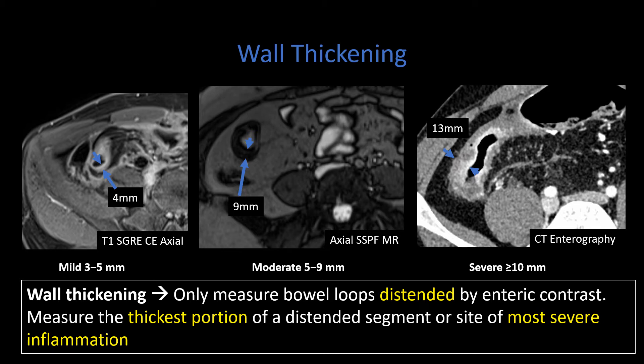When you think about wall thickening, there are different grades — mild, moderate, and severe. When assessing wall thickening, make sure you have adequate distension of that loop of bowel with oral contrast, then measure the most severe area of wall thickening in the area showing distension. We can see here some mild wall thickening at 3 to 5 millimeters, here 9 millimeters, and here 13 millimeters — showing those different grades on MRI and CT.